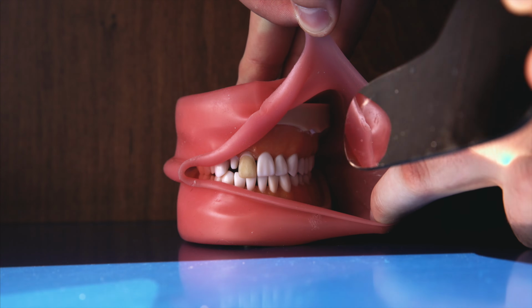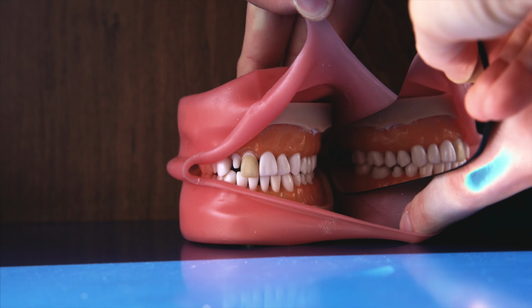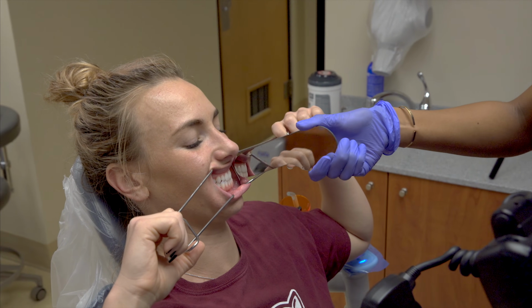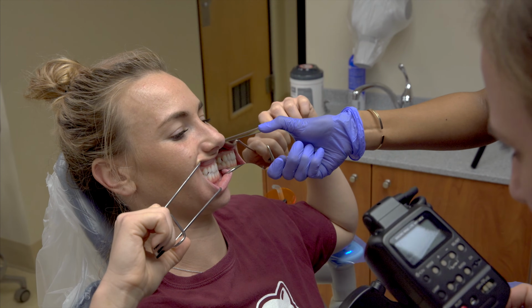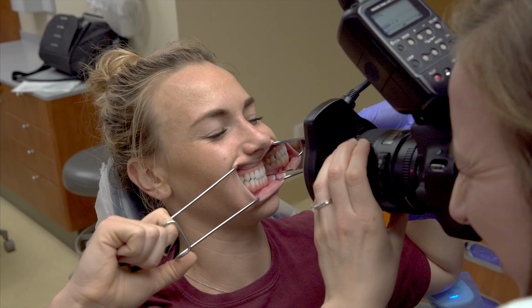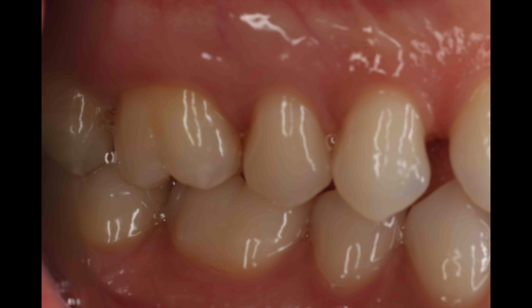Here is an exaggerated demonstration of the mirror placement on the contralateral side on the model. The mirror is slanted slightly upwards in this clip, but the 45-degree angle and buccal movement can be seen. Here we demonstrate the same technique, but on the opposite side. The photographer gets ready to take the photo, then tells the assistant to move the mirror buccally. This image shows the mirror outline, but overall is not a bad shot. This photograph demonstrates what a photo may look like if fog gets on the mirror.